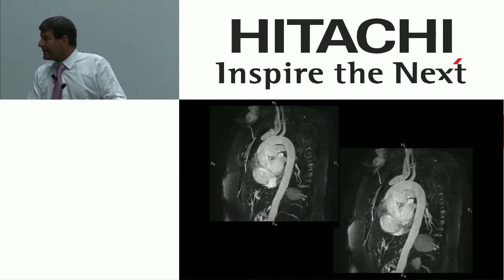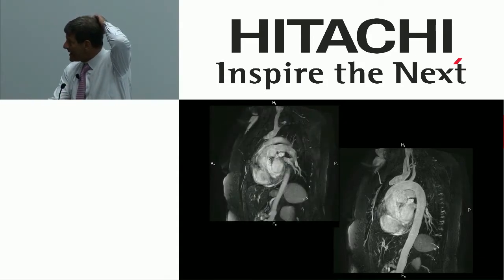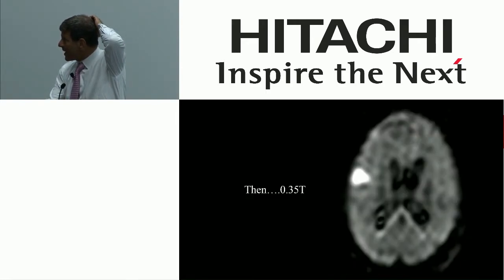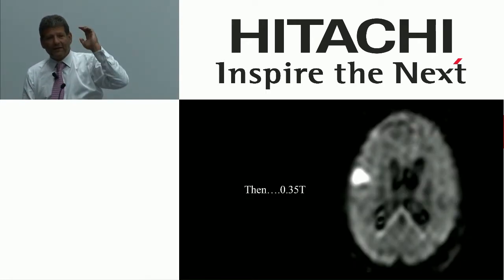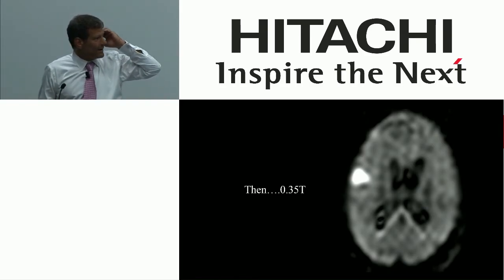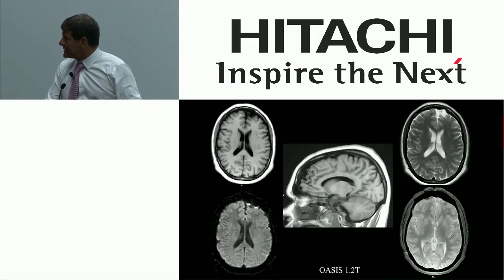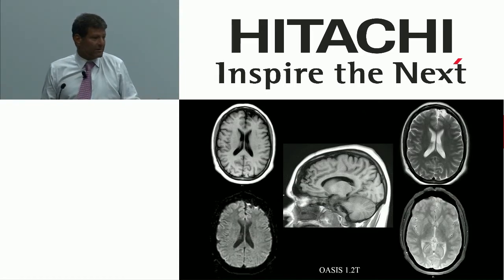Cardiac work, I would say that you should be able to knock out a basic cardiac exam without any particular problem. The key thing is again, this is what we used to deal with, right? This was a diffusion scan, and it was a miracle on our open system. It was a miracle to be able to do that. This is what we get today. We get images that are high-field images.